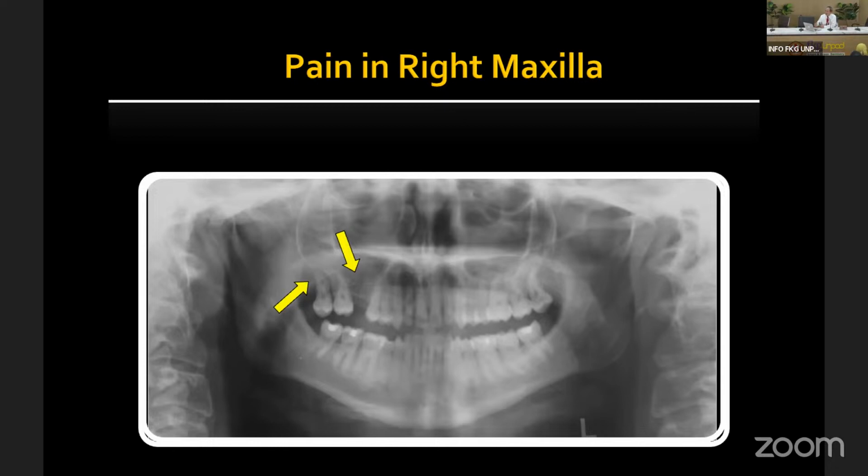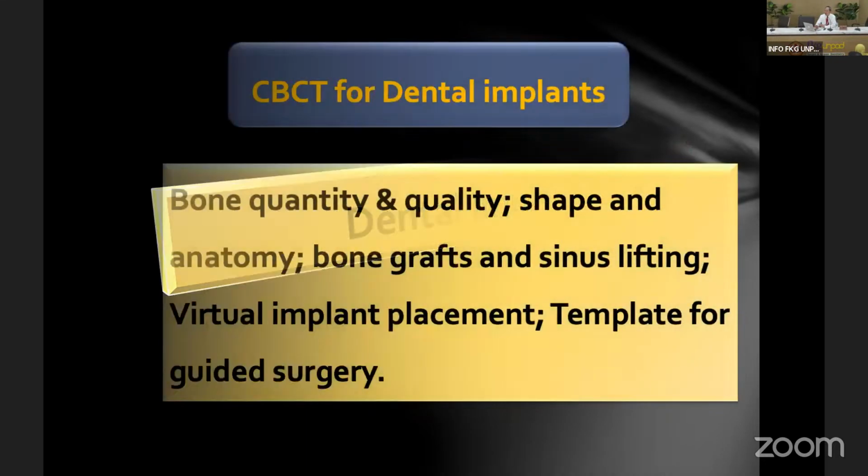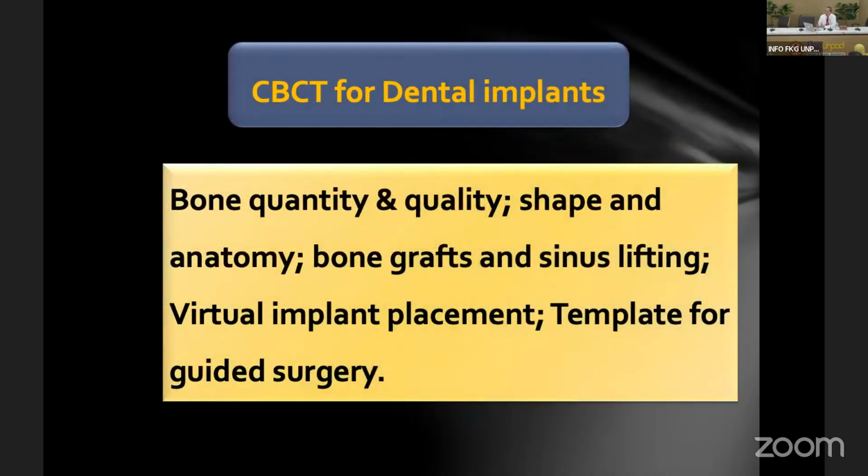But again, if we are busy in the clinic, we can probably miss this kind of pathosis on the panoramic film. But with cone beam or medical CT, we should be able to recognize that kind of lesion. So that's how cone beam CT can help our diagnosis. For dental implants, this is actually the driving force for having CT or cone beam CT in dentistry.